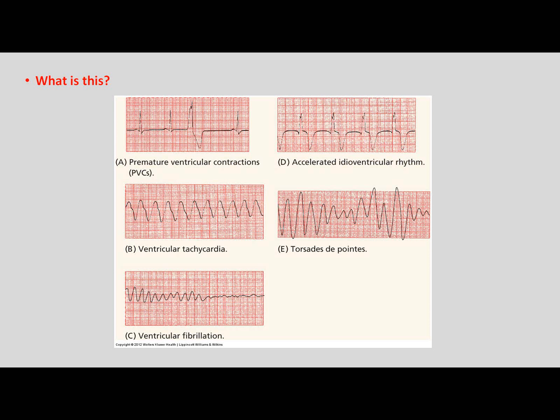Ventricular ones. So here, one PVC. So it's just a single PVC. It's because it's wide, it's odd looking, and QRS and T waves are opposite. Why is this accelerated ventricular? Because you have a decent rate, and it is generally benign, meaning safe, and the patient will be okay. But it is coming from the ventricle because it's wide.